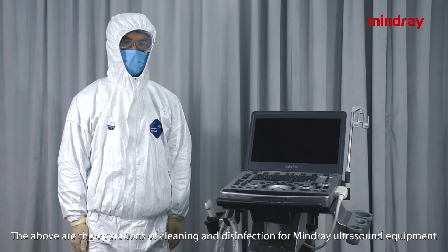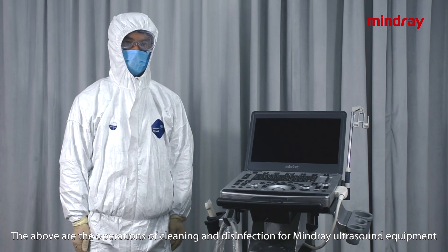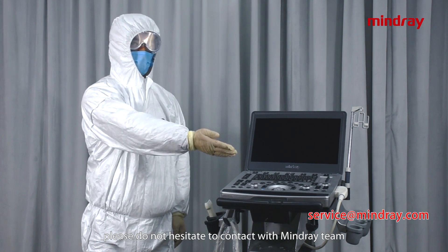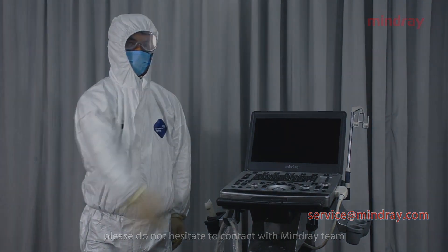The above are the operations of cleaning and disinfection for Mindray ultrasound equipment. Should you have any queries, please do not hesitate to contact the Mindray team.